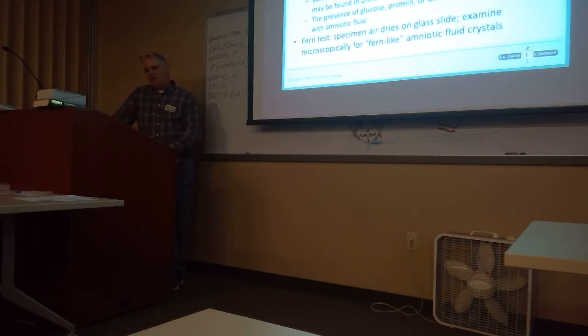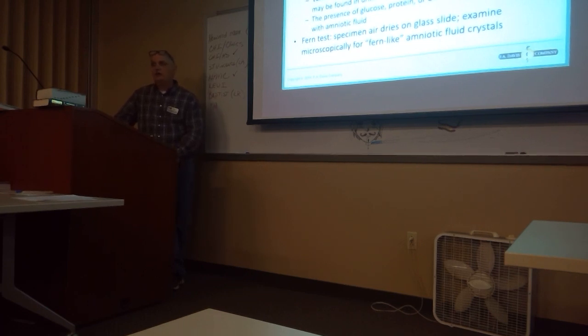And for some reason, and I was talking to Jason about this before class today, they do this test all the time at National Park Hospital. They want to check and see if it's amniotic fluid. I never once did this test at St. Joe or CHI, and I don't understand why, because they both deliver babies, and I would think both of them would do it all the time. But if you go to National Park Hospital, you will more than likely see this Fern test.